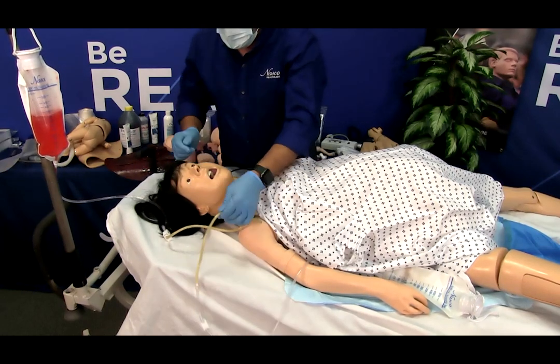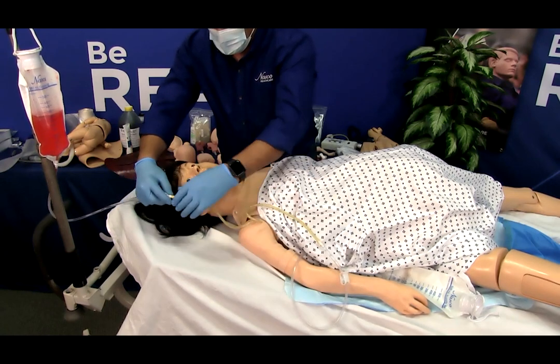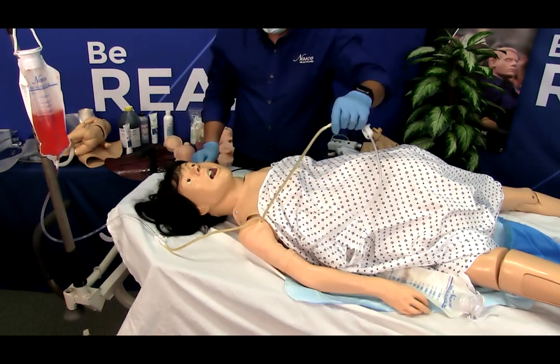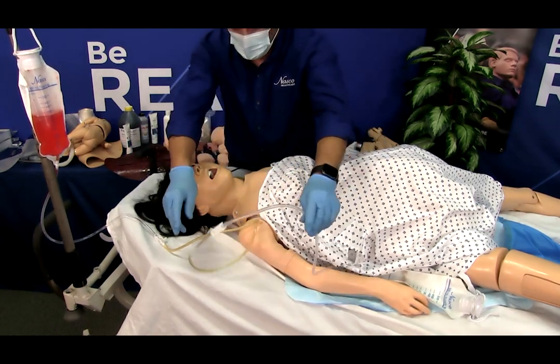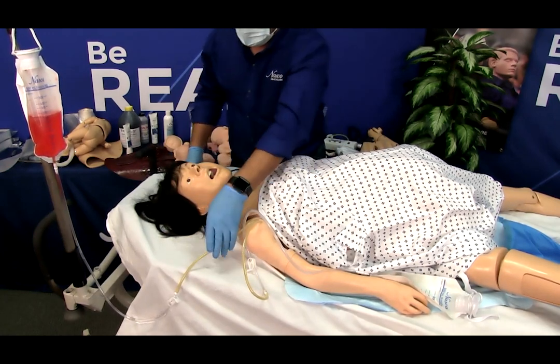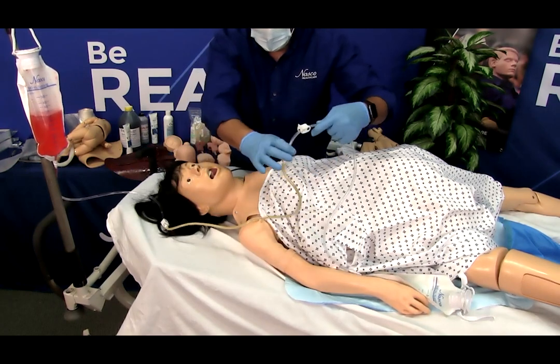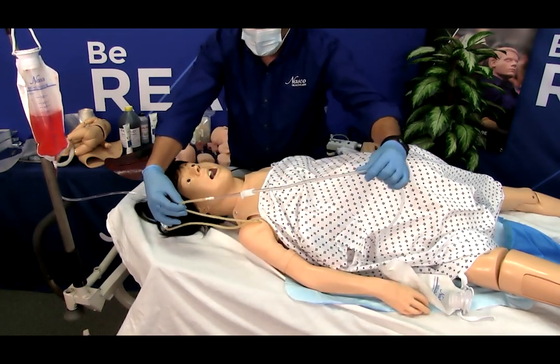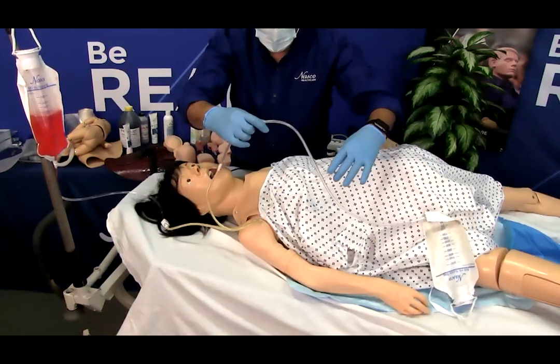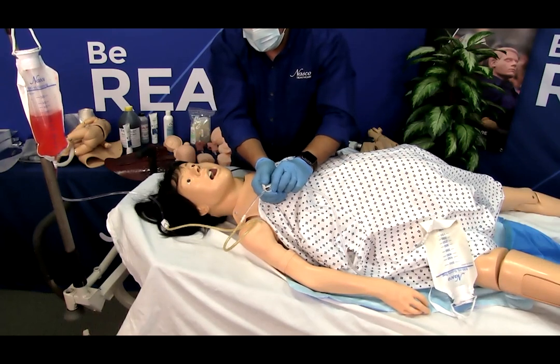Attach the tubing on IV bag A to one of the shoulder tubes. Since this is a single tube loop system, it does not matter which tube you use. This will now be the inlet tube. Use a second shoulder tube for the draining. This will be the outlet tube. With the outlet shoulder tube attached to the second IV bag, we will call this IV bag B, make sure the clamp on the drain tube is open.